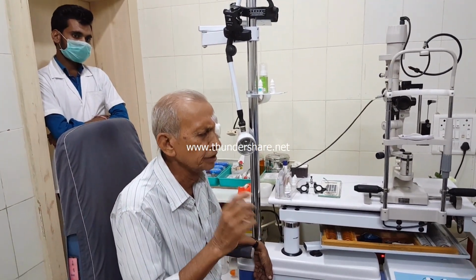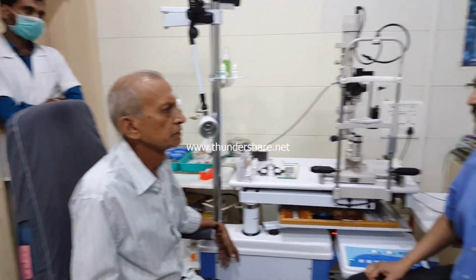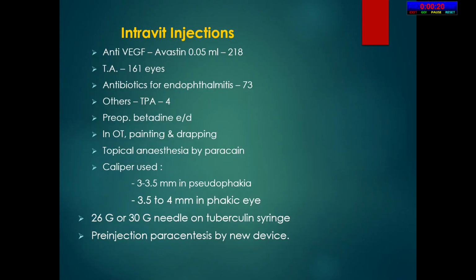So this is a very good advantage, that the patient doesn't feel any pain because there is no increase in the volume of intraocular pressure. Okay, so are you feeling fine now? Is there any discomfort? No discomfort at all. Okay, thank you. So it's the patient's feedback.